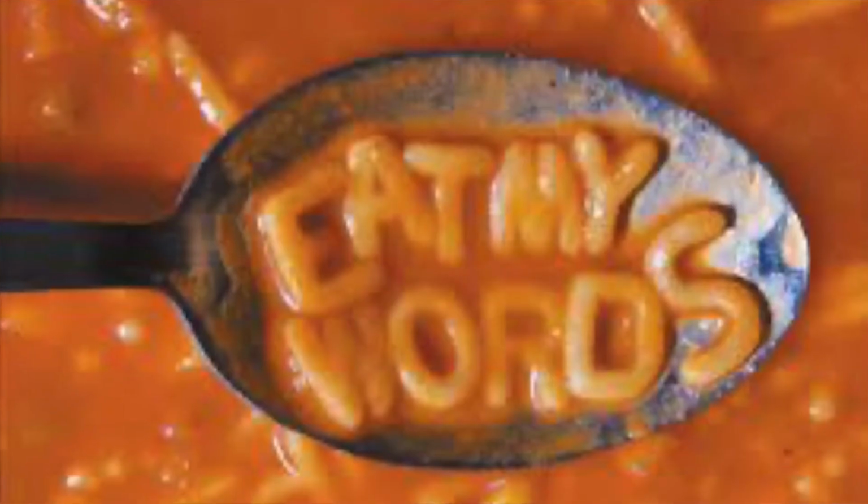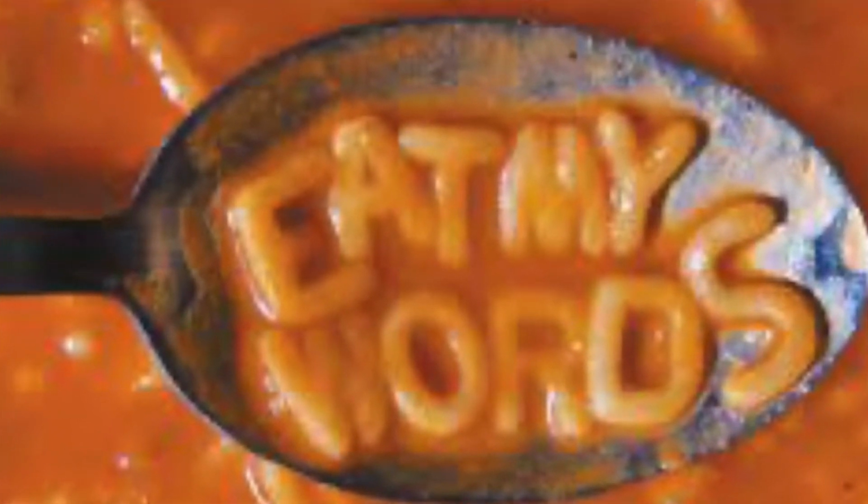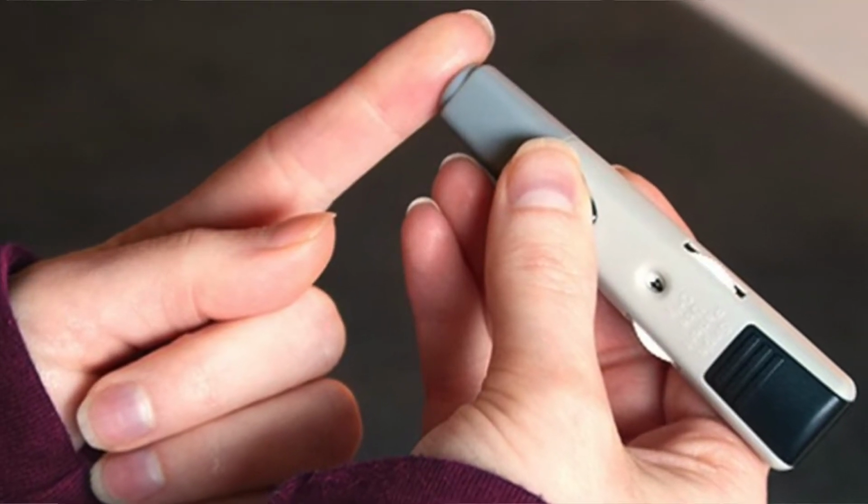Well, I have to eat my words this week because I think anybody who's got metabolic dysfunction, anybody who's got prediabetes, anybody who's got diabetes especially, needs to be wearing one of these continuous glucose monitors because it tells you at any given time during the day what your blood sugars are doing. And if you, like me, are worried about insulin resistance and chronically raised insulin throughout the day, this tells you when that's happening. And I don't have to go through the process of sticking my finger and drawing blood and testing it that way.